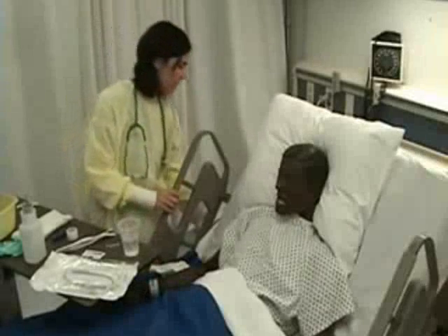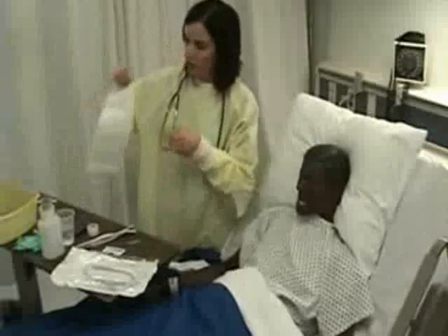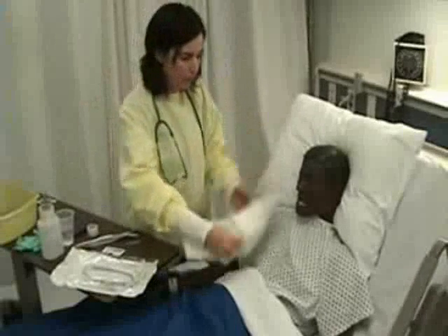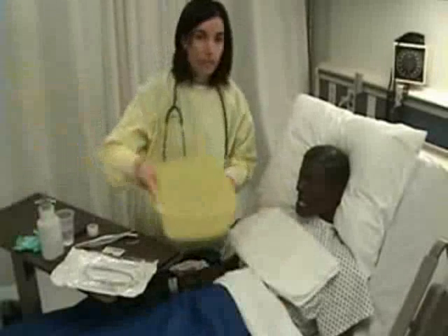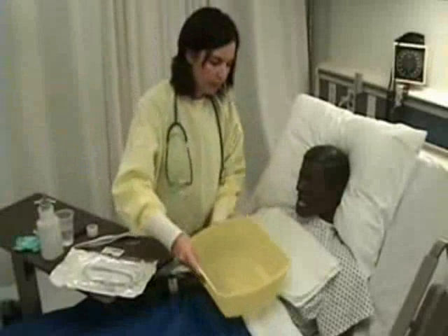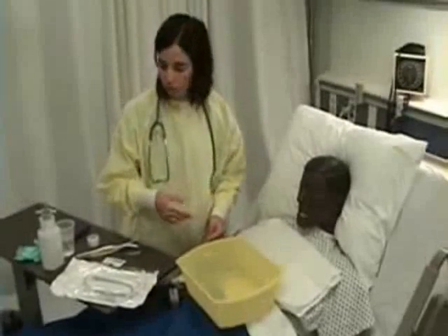I'm going to put my side rail down. I will place my non-sterile drape across his chest. I can give him a basin to hold in case he has nausea or vomiting. I want to perform a thorough assessment on my patient before I insert my NG tube.